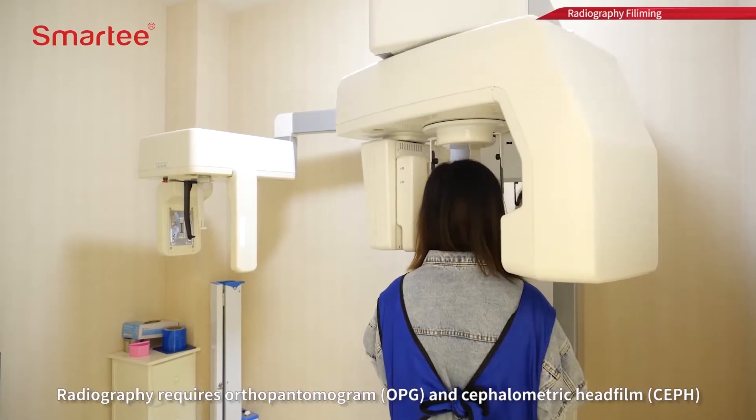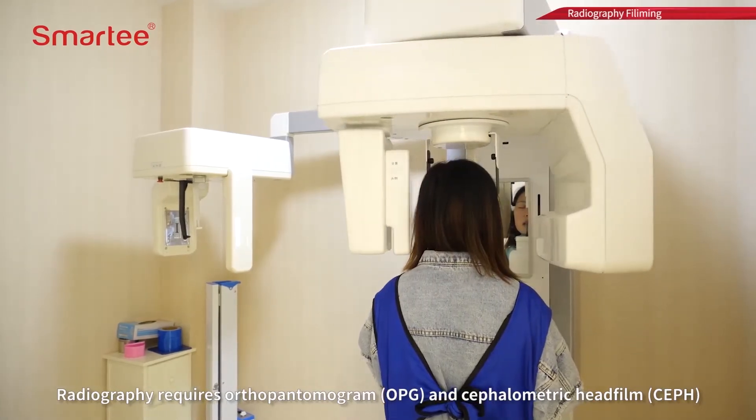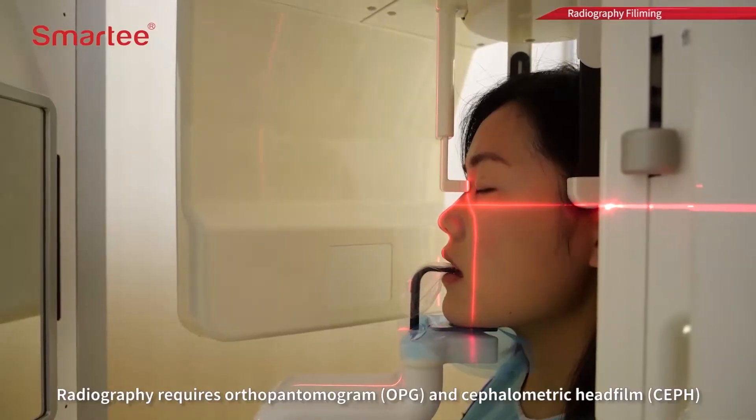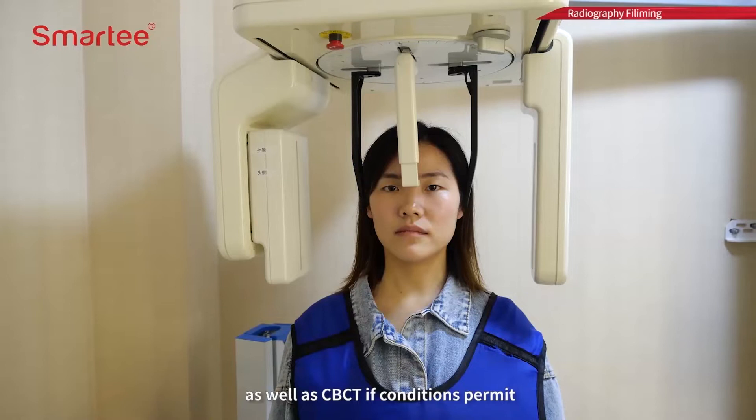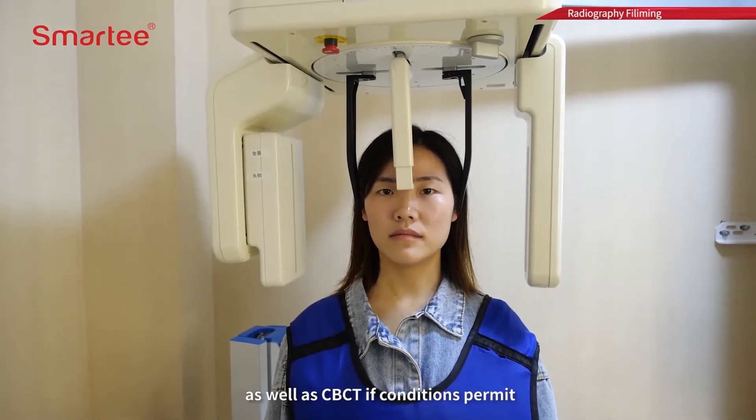Radiography requires orthopantomogram (OPG) and cephalometric head film (CEPH), as well as CBCT if conditions permit.